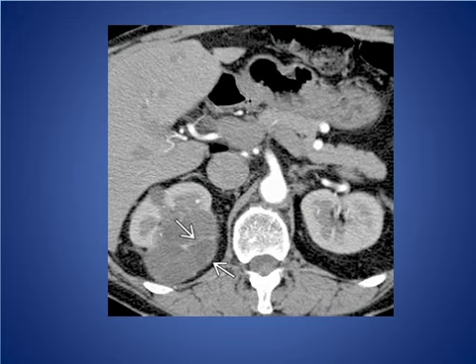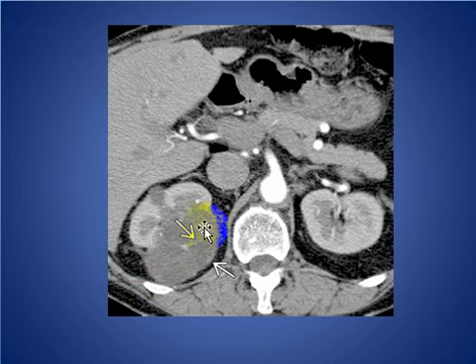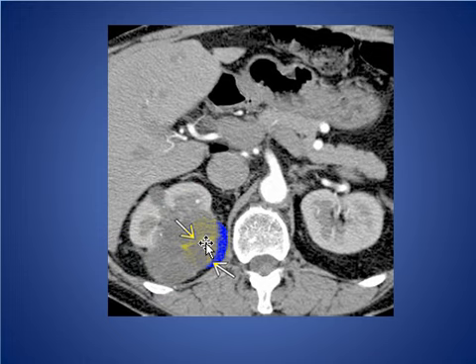Here is another patient with a right kidney mass showing thick enhancing septation, consistent with renal cystic tumor.